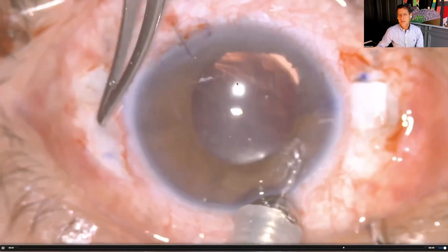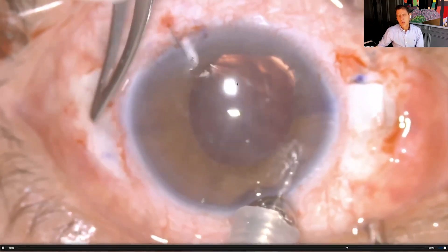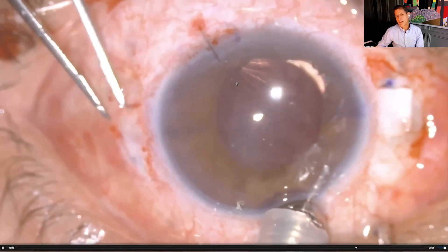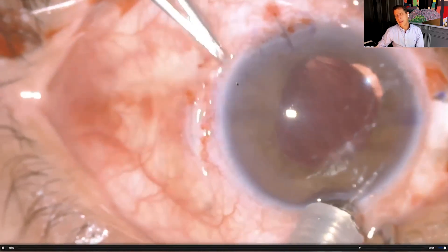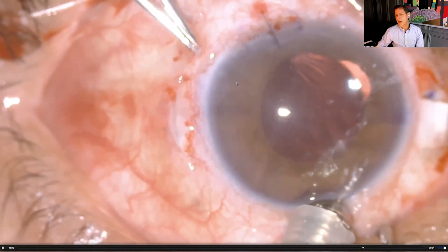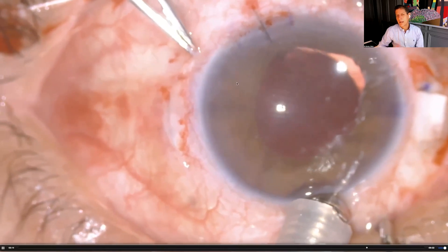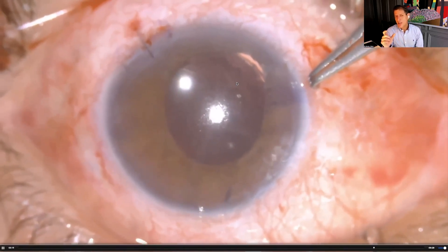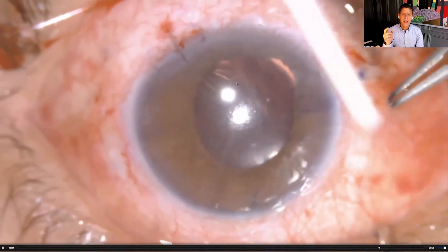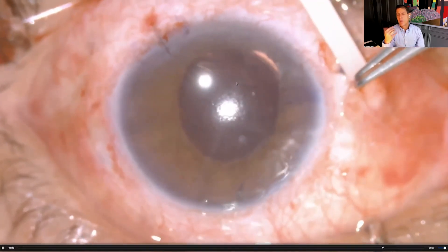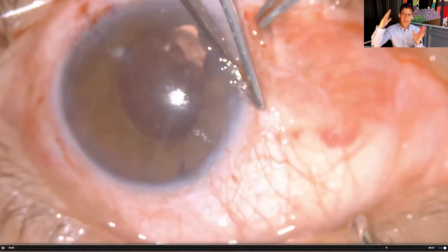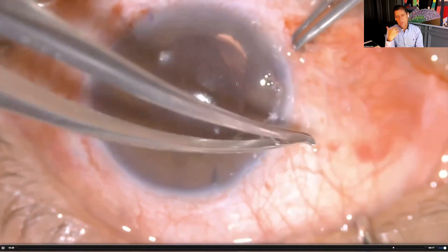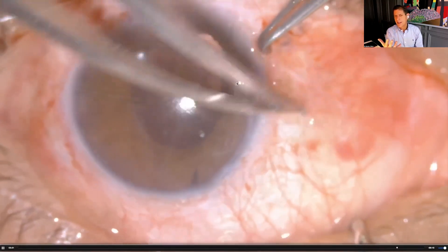Once exteriorized, we introduce each haptic into the previously created tunnels. With all measurements done, the lens sits very well with no tilt. Tissue glue fixates the flaps and conjunctiva. For IOL power calculation I use the Barrett Universal II formula and the SRK/T formula — predictability is very high when the lens is placed exactly 2 mm behind the limbus.